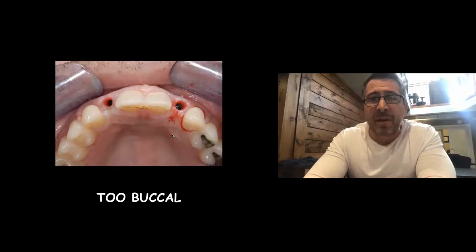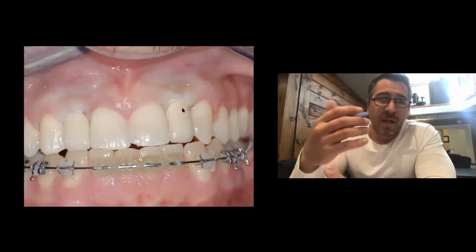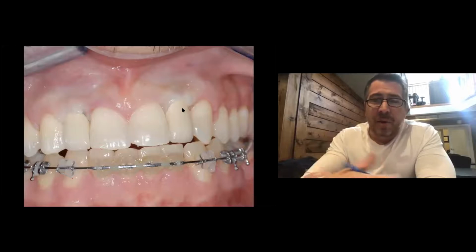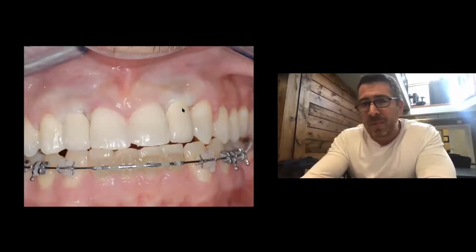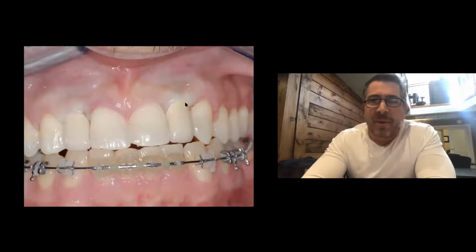Now, what happens when we place implants too buccal? If they go too buccal, then we end up with zeniths being in the wrong position. Anybody that does ortho knows that if you push a tooth buccally, the tissue will recede, and if you pull the tooth lingually, it might migrate up coronally on the tooth. Same thing with implants. If things are too buccal, you end up with a problem with zenith.